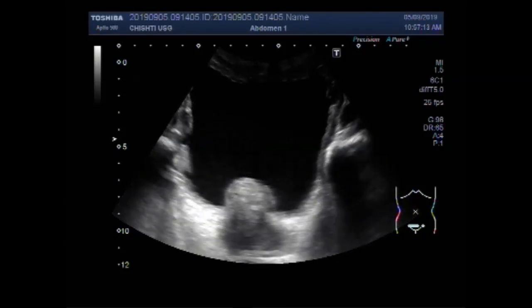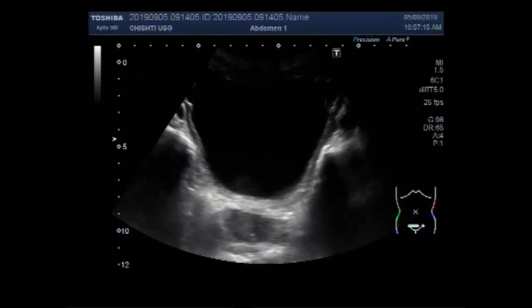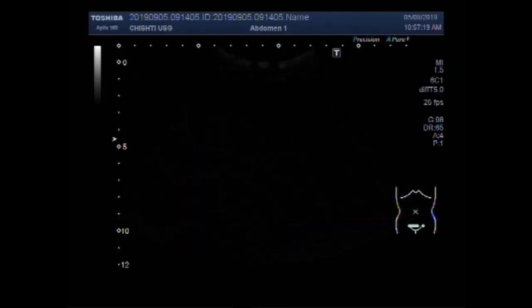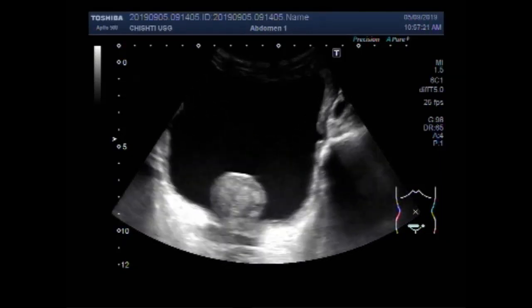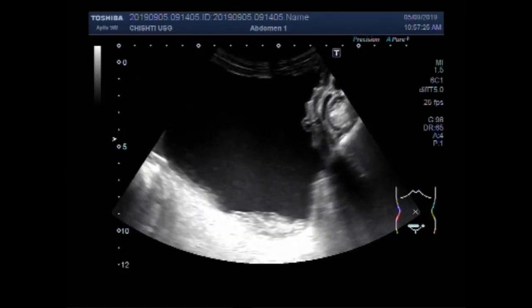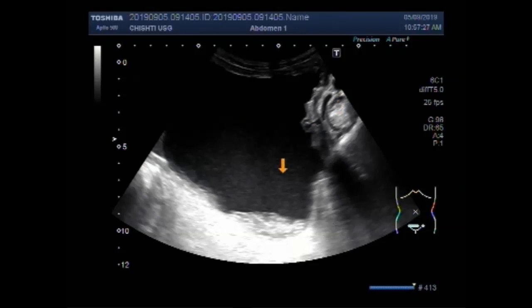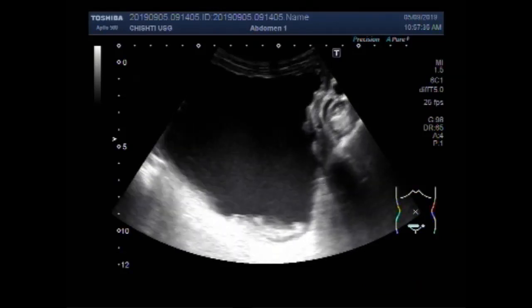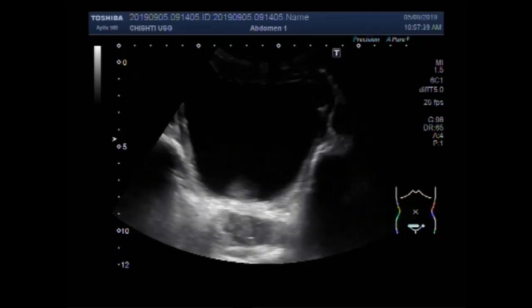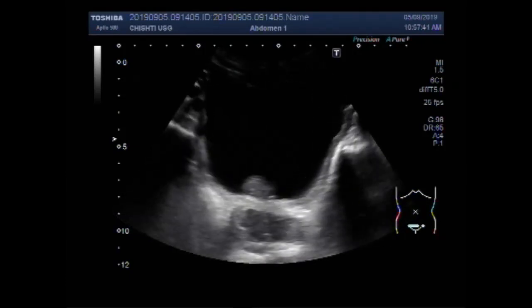It is an approximately oval-shaped mass having semi-solid to solid consistency. This is debris or thick sludge deposited in the dependent portion of the urinary bladder, at the base of the urinary bladder.